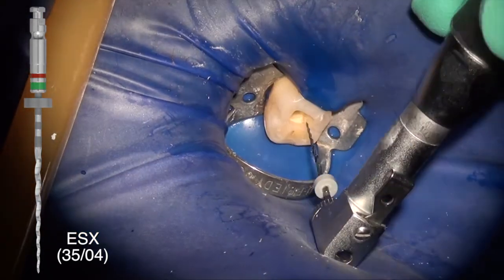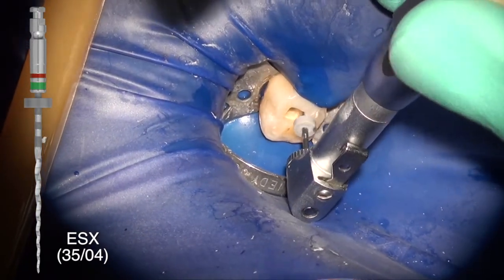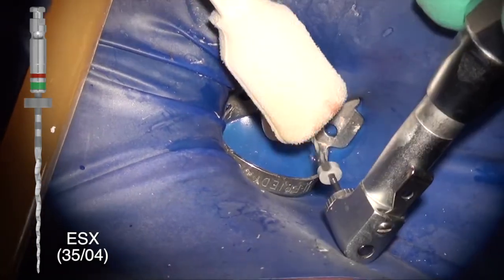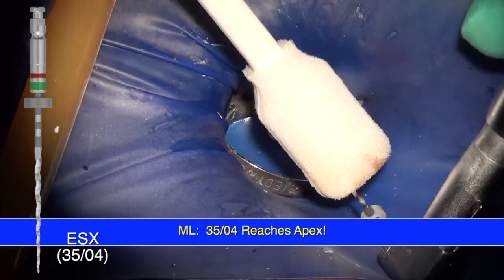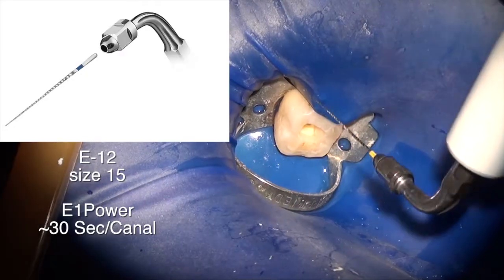So on the mesiolingual as well, I'm doing the same thing, the multiple strokes here. Every single stroke, however, is followed up by wiping and cleaning. This way no debris is let loose in the canal. And after about 3 or 4 strokes, I would end up then using the ultrasonic with water to very quickly remove any remaining debris that is left.